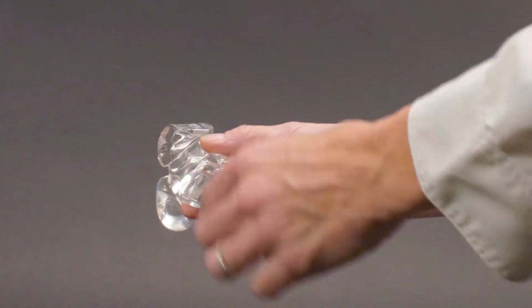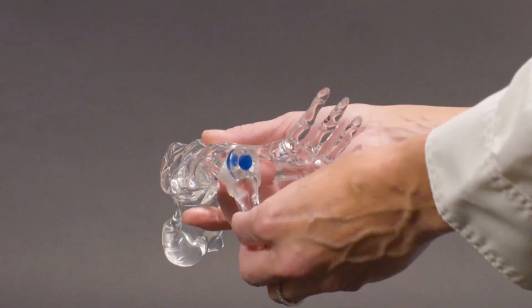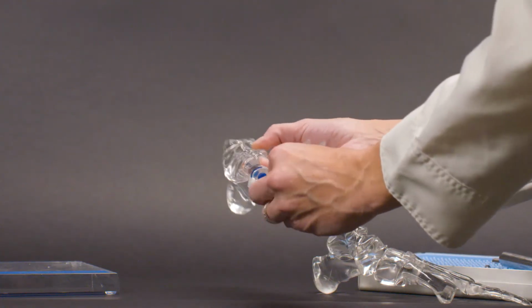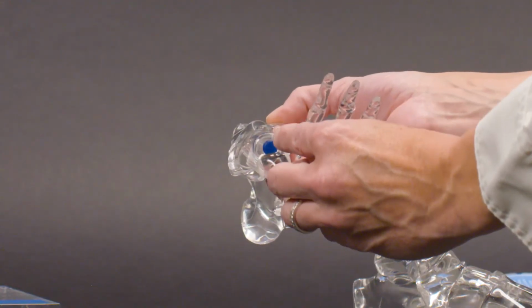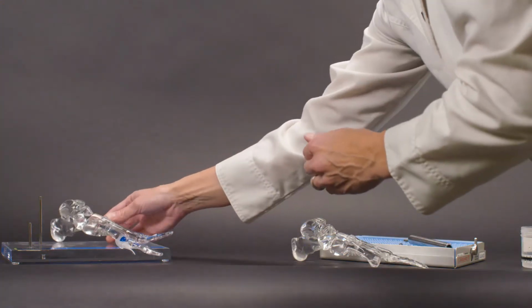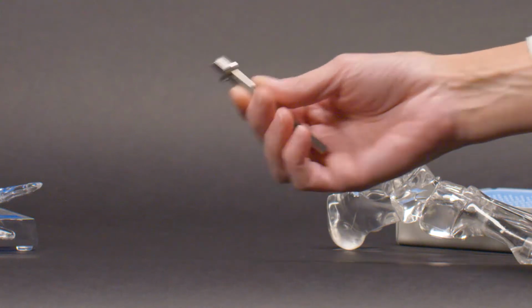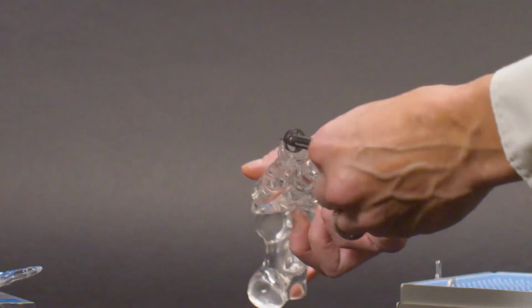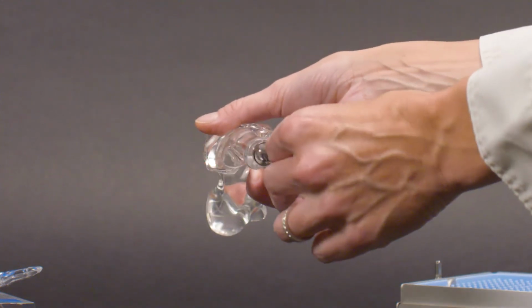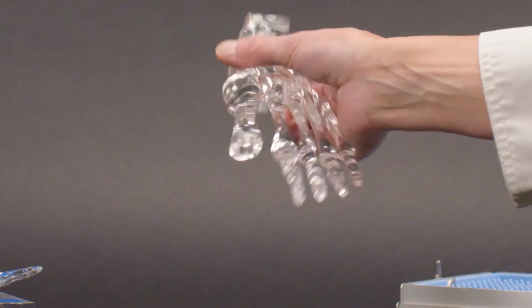So for the surgery, what we do is open up the joint, release all of the ligaments, get rid of any osteophytes and other problems, and then almost fully dislocate the toe. At that point, we can see the surface of the bone where the arthritis is mostly sitting. We then use this device, a specialized proprietary reamer made for this system. We attach it to a power drill, for lack of a better term, insert it into the great toe, and ream out an aperture to accept the cartilage replacement system, or the Cartiva, okay?